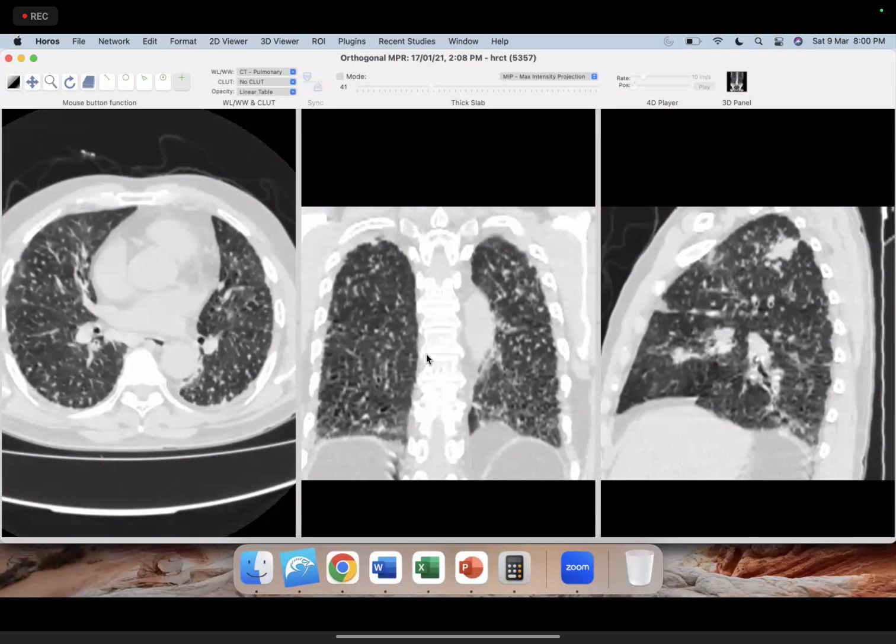Now I think we can take just one last question. Can you explain interstitial lung abnormality? Yes, interstitial lung abnormality is something that we did not touch upon. Number one thing is that interstitial abnormality is when there is no clinical suspicion for ILD. So the scan is not done to find out ILD. You instead pick up reticular opacities or signs of ILD as unexpected findings. So the patients are also not symptomatic for those findings per se. Even if they have symptoms, it may be related to something else, and typically it occurs in the elderly.